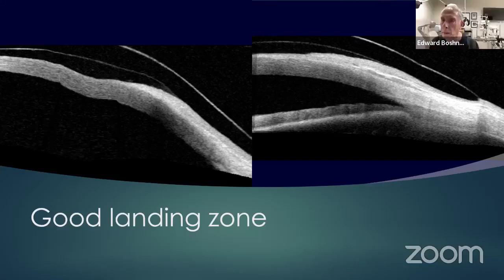If I need more clearance, I'll just tell the lab I need an extra 100 microns of clearance, or I'm getting some limbal staining, or there is an impression at 3 o'clock or 9 o'clock. I'll take photographs, send the photographs and all the imaging to the lab, and call them on the phone. They're looking at my images and photographs while I'm looking at them, and they understand what I need done. They make up new lenses. We don't send the lenses back.